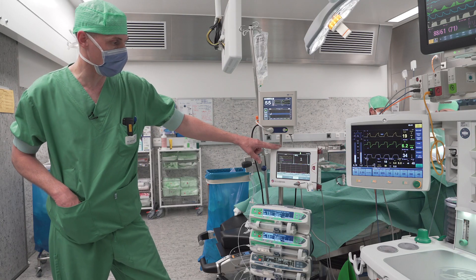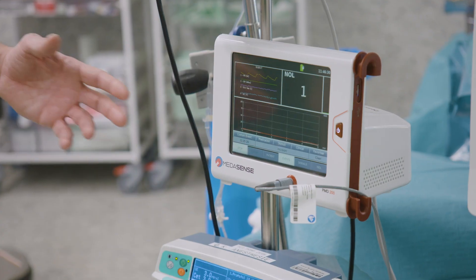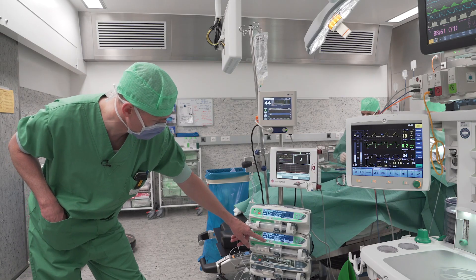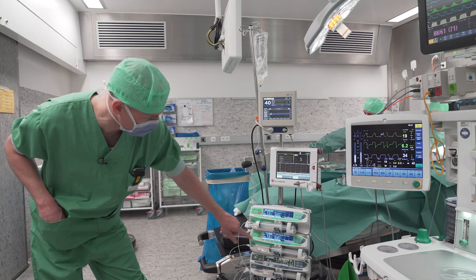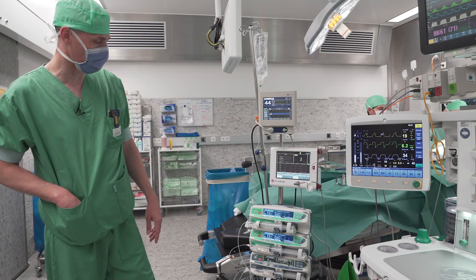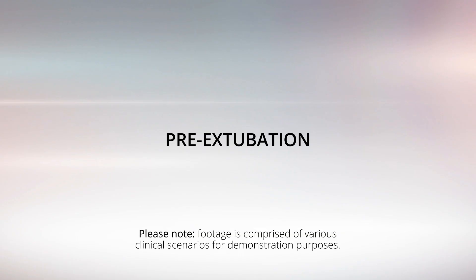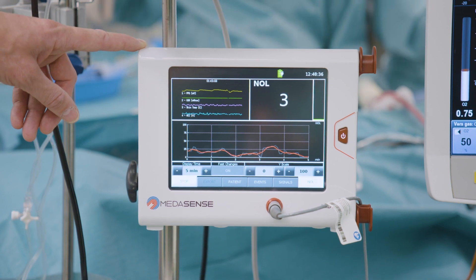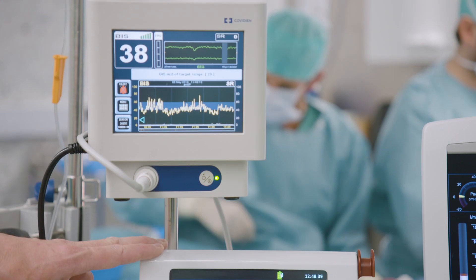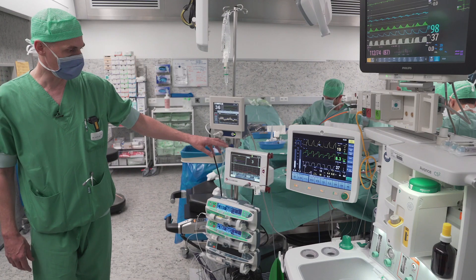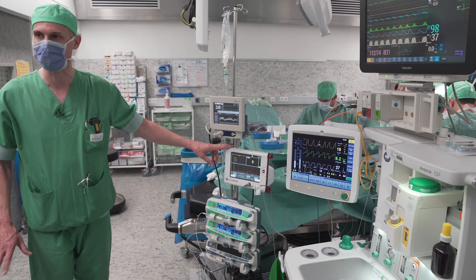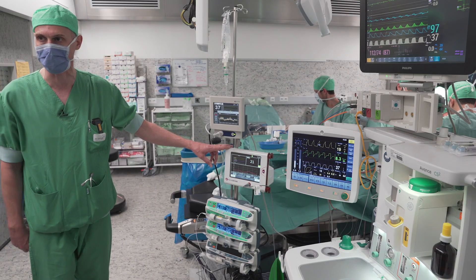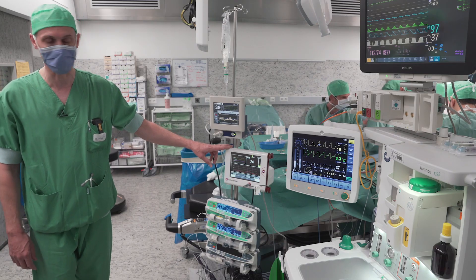The NOL monitor indicates for quite a long time that there's an excessive analgesic effect, so I'm going to decrease my remifentanil now, again to lower values. I'm going to go in steps of one nanogram per milliliter. I already start anticipating to decrease my concentrations. Both the BIS and the NOL are safeguarding the patient's condition. So if they suddenly start to increase, I know I have to stop my decreasing maneuvers — then I'm just at the edge of waking up the patient. These are strategies that we can use to optimize the recovery.